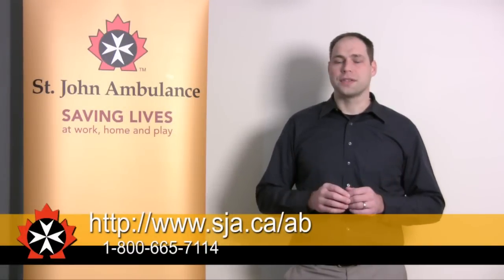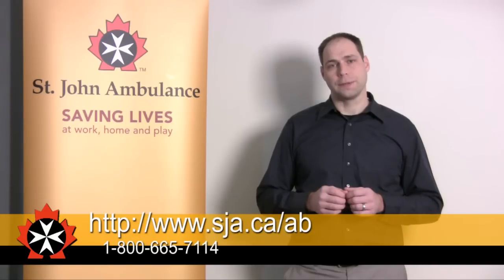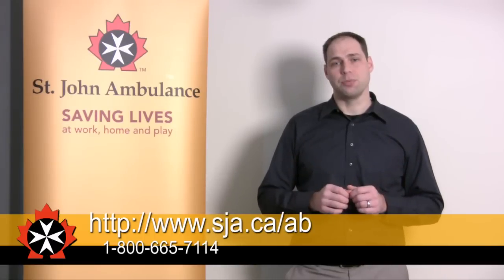Remember, in an emergency, it's people like you that can do the greatest amount of good when you first come along a casualty. What we've just seen is a small piece of what you would find in a CPR course.